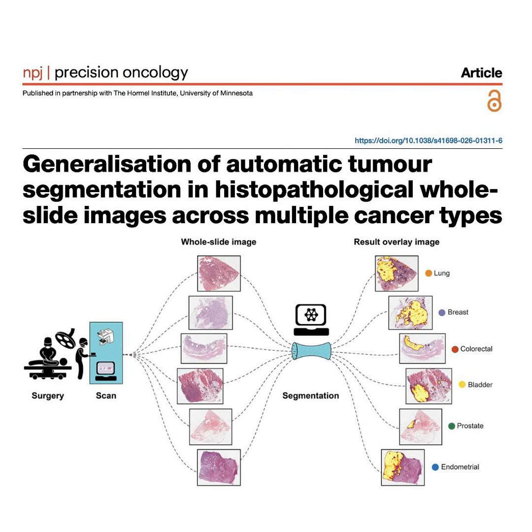And just to clarify, the Dice similarity coefficient is basically an overlap metric, right? Yes, exactly. It measures how perfectly the AI's predicted tumor boundary overlaps with the true human-drawn boundary. So scoring over 80% on an alien tissue type is an absolute triumph. It's incredible. And for the endometrial cancer validation, it scored an unbelievable greater than 90%. Wow. So it successfully took the universal rules of cancer it learned and just applied them anywhere.